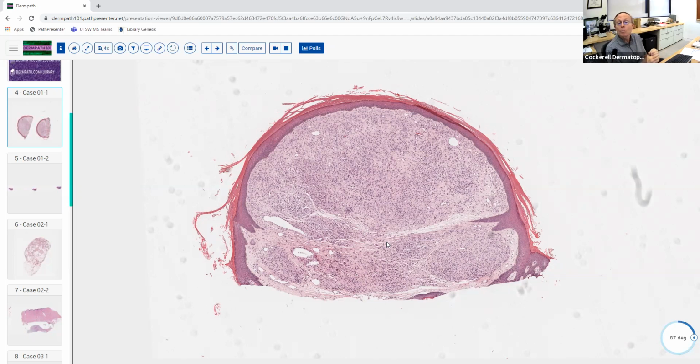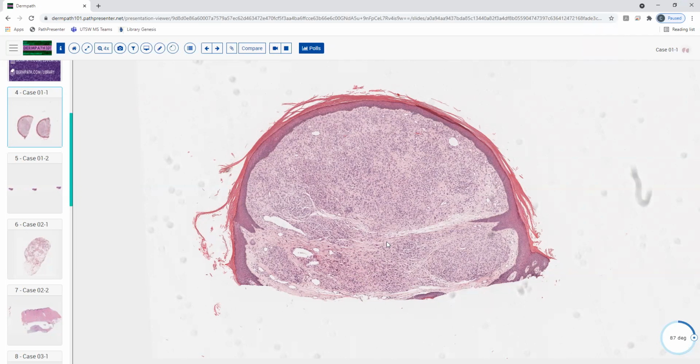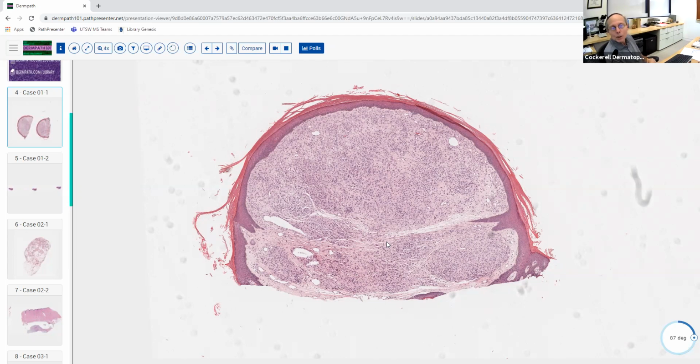Epithelium tends to be more cuboidal. The cells have desmosomes, they're touching one another. Whereas non-epithelial, what do they generally tend to look like? They're usually more dispersed and kind of spaced out. What's the most common shape of a non-epithelial dermatologic neoplastic process?